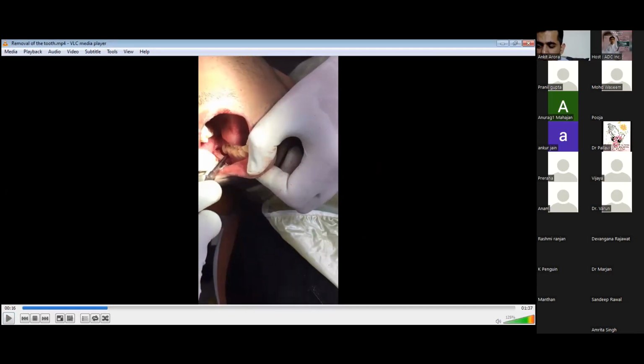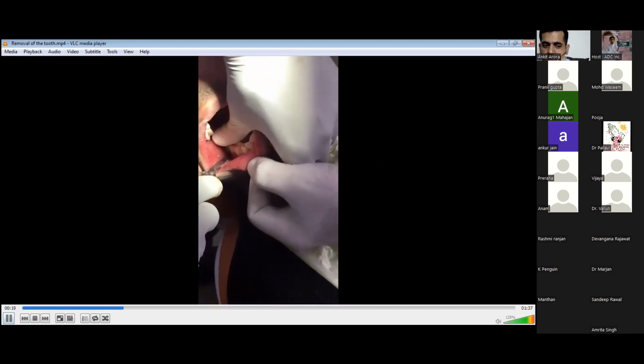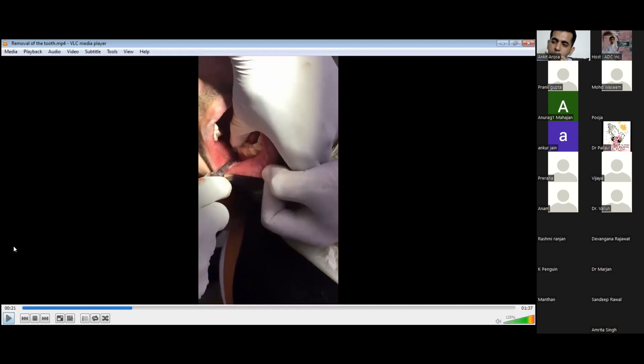You need not go into the lingual pouch. I'll repeat, you need not go into the lingual pouch, but you need to put your pressure against the socket, against the tooth. Like this, we'll put our thumb between 7 and 8, so as to put digital pressure on 7 and 8 while you are luxating the third molar. It should not be that you are putting pressure and ultimately you luxate the 7. Irrespective of the fulcrum, you ultimately remove the 7.